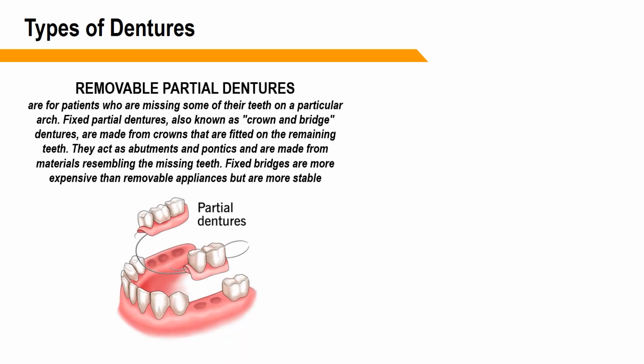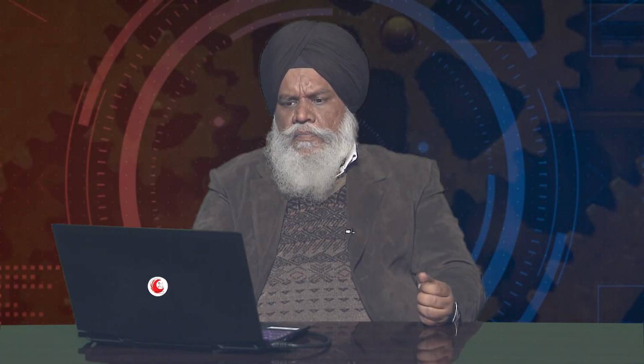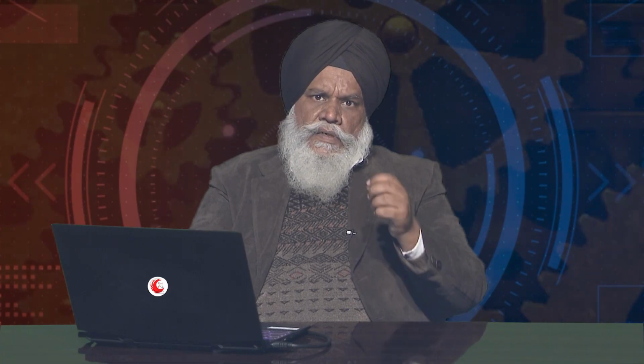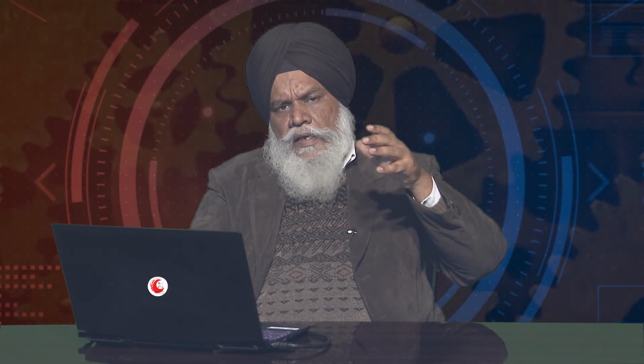One is whether I am interested in a removable or non-removable denture, then whether it is a partial denture or a complete denture. Full removal is a complete denture, partial means at some places I am putting it, right? People in prosthodontics have a lot of application for this type of material. From the surgeon's point of view, it is divided into two types: the upper arch, which they call the maxillary, and the lower arch, which they call the mandible.